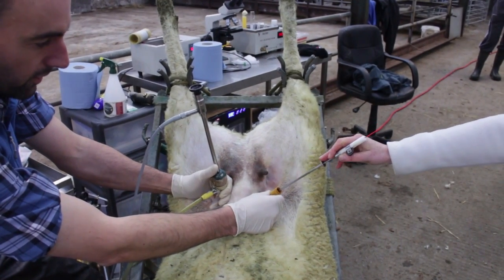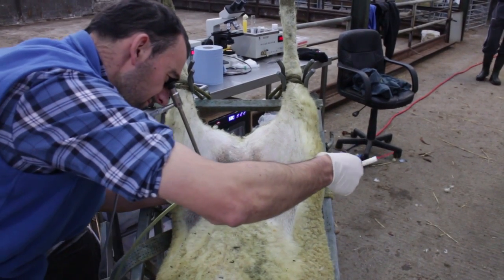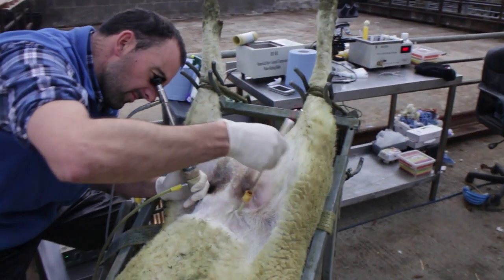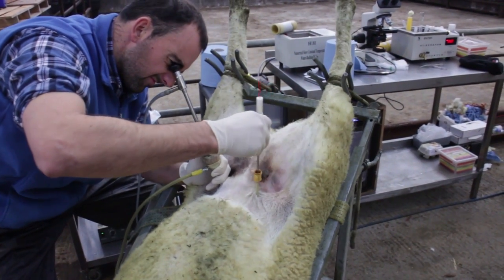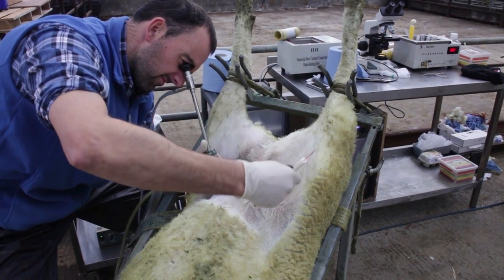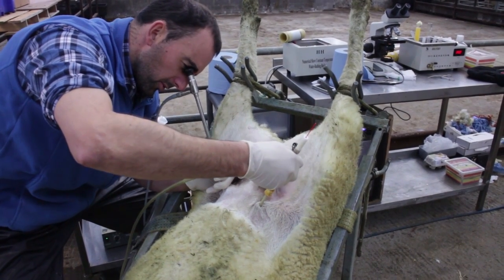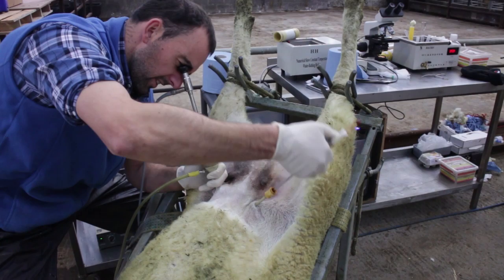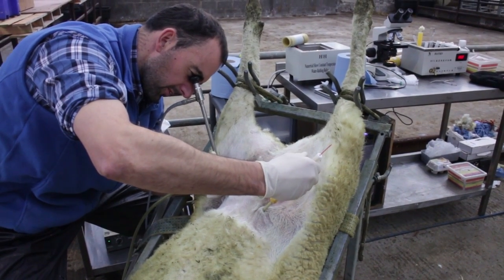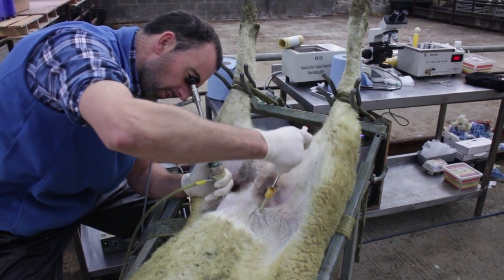The AI gun then goes in on the right hand side. I'm using the probe on the tip of the AI gun to move the bladder to one side. The uterine horns then move into position. We generally inject the semen into both uterine horns — left and right. I'm now injecting into the left side; about 0.1 ml of semen is done in there. Now moving out and across to the right hand side.